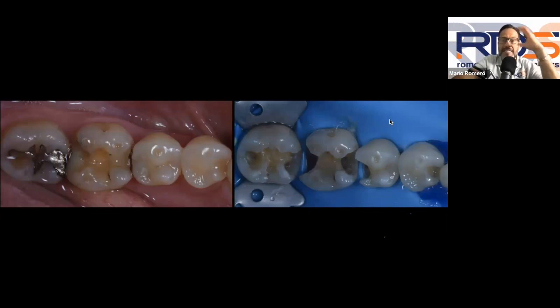And again, that's one thing that I teach on my rubber dam isolation webinars, part one and part two, which I highly recommend that you watch if you haven't done so yet, because this is where you're going to learn these little tricks that make isolation much easier and practical in your everyday clinical strategies. Now, the clamp that I'm using here is either the 12A or the 13A. These are two clamps that have multiple beaks. You can see that the beaks on the buccal are wider, the beaks on the lingual are narrower, which helps you really stabilize that clamp.